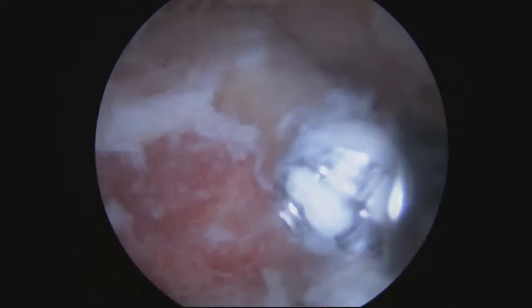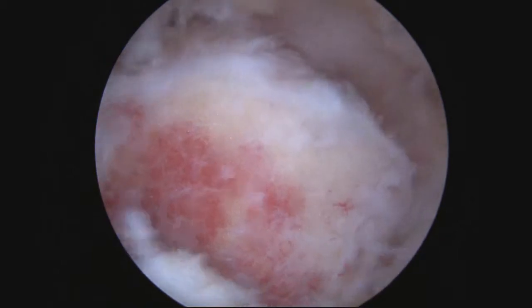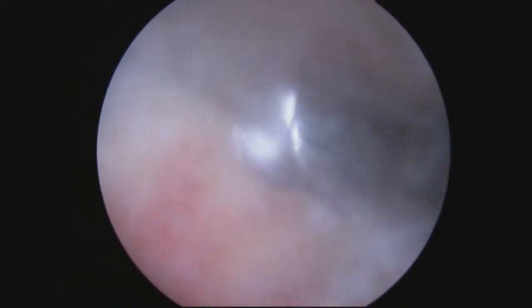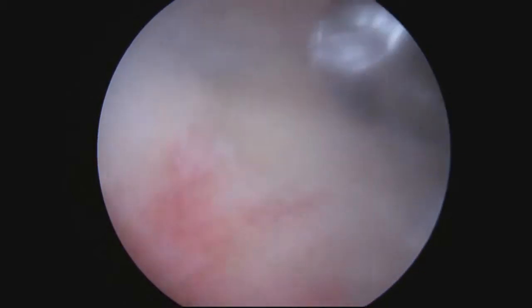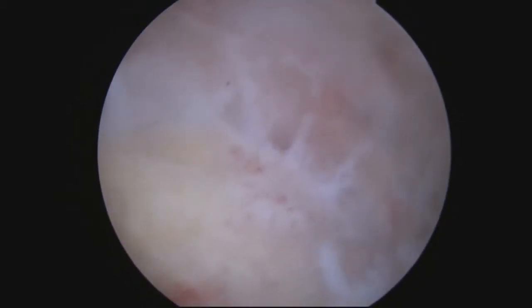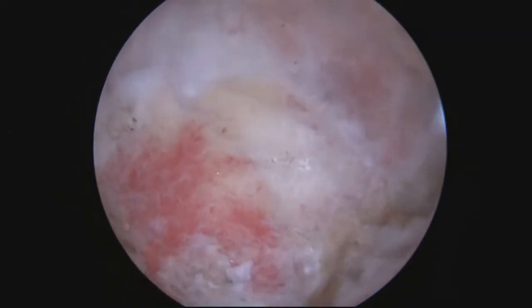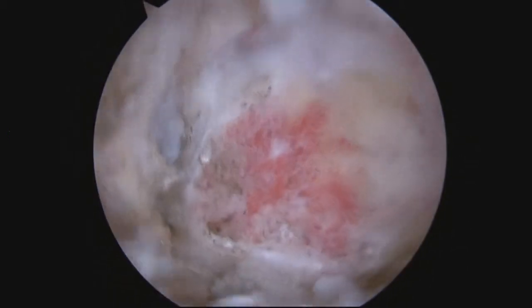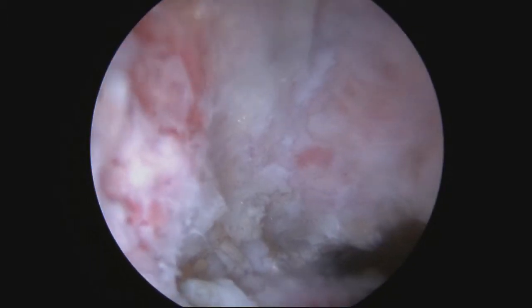Once I've taken off the bottom part of the clavicle, I'll just move upwards. I want to create a nice, smooth resection — taking enough so that the bones no longer impinge and cause pain. You can see here the nice, even resection. It's very nice and smooth.